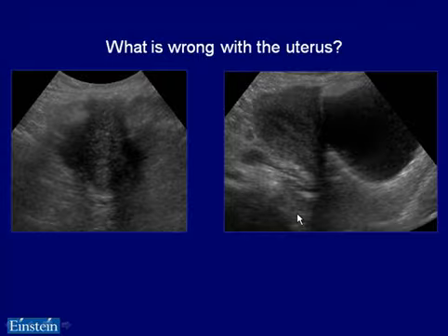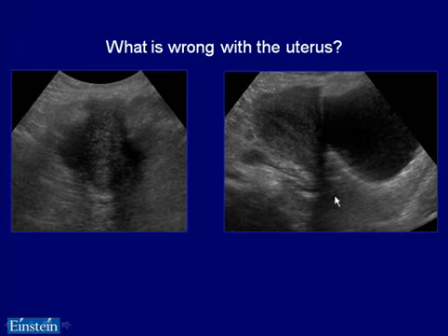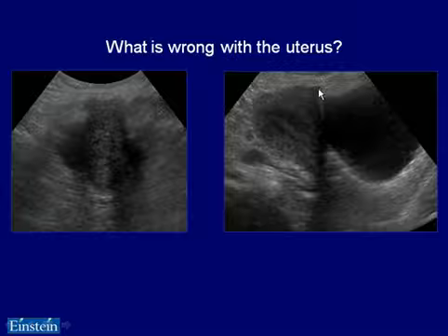We initially looked transabdominally, and there's a very odd shape and contour to the uterus. So in the sagittal view, head here, feet here, this is the urinary bladder, vagina. You notice the cervix, and it appears relatively elongated, and then if you follow the uterus up to here, it's tethered and pulled right over here.